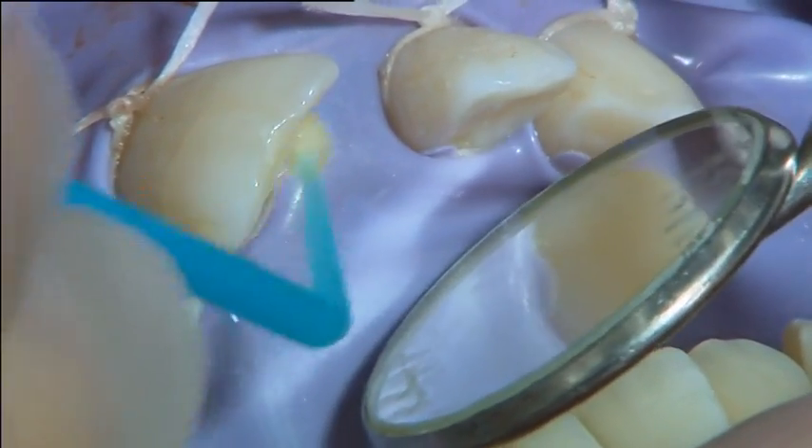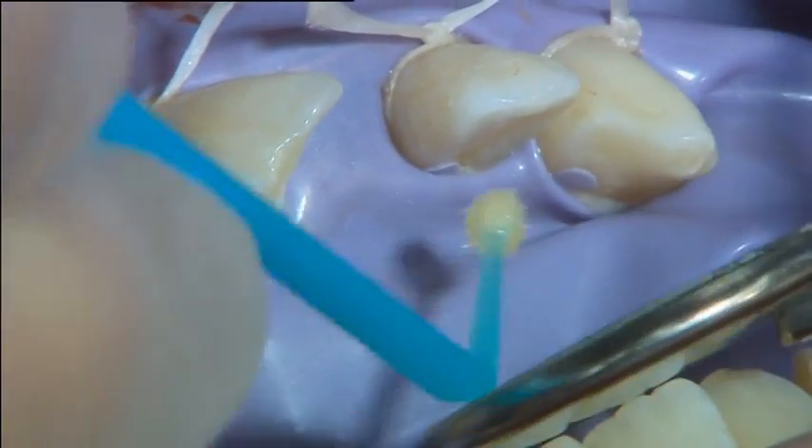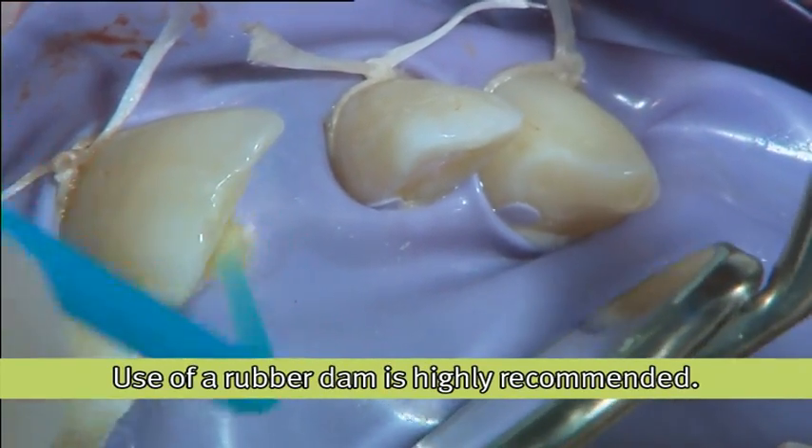The surfaces of the teeth were etched with orthophosphoric acid, rinsed with water and air dried. The bonding agent was applied onto the teeth surfaces and light cured as described by the manufacturer.